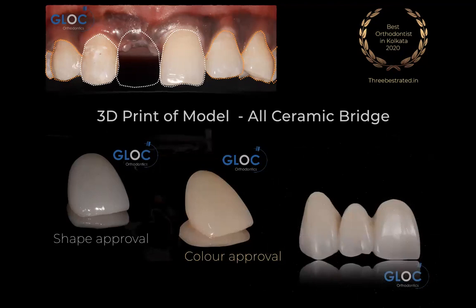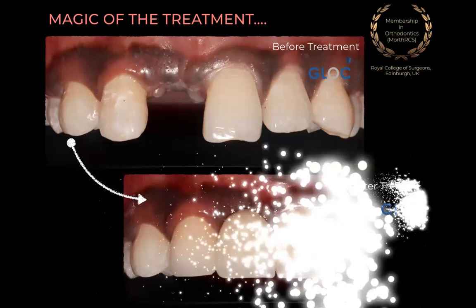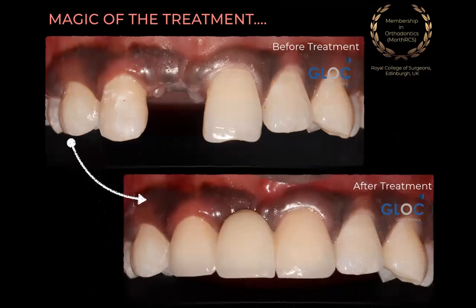So the patient is involved in every phase of the treatment so that there is no confusion about the final result. Once the consent is given and the final results have come, we fix the bridge into the mouth. And this is the magic of the treatment that we get. This is before treatment and this is after treatment, where no one can understand where the crowns are. It's absolutely precise. The colors are matching and therefore the patient has no problem at the end of the day in smiling or in social occasions.